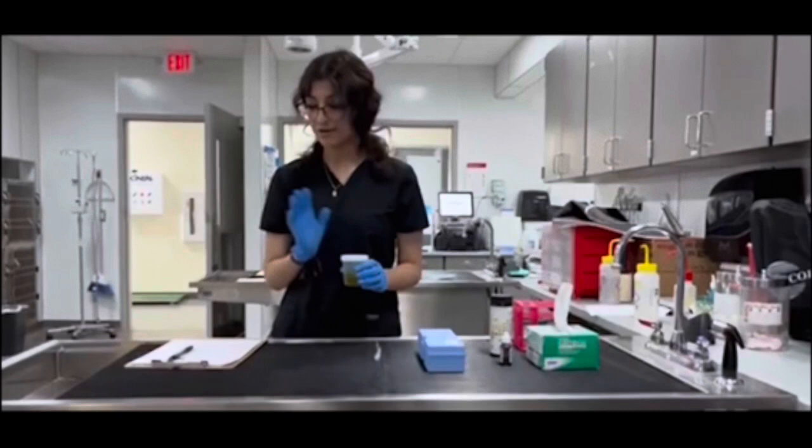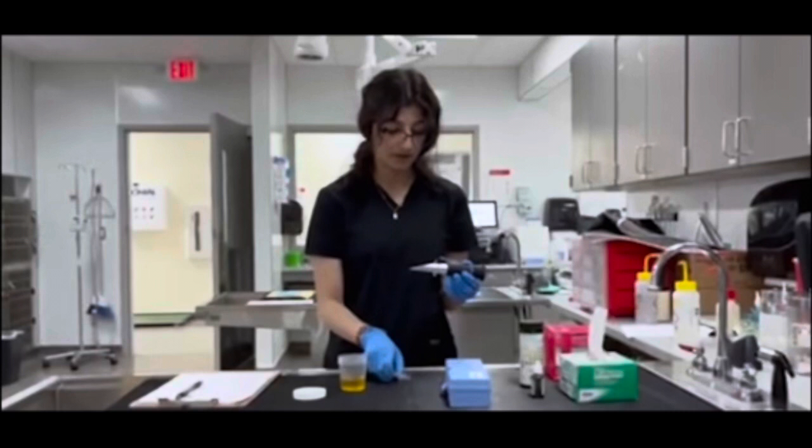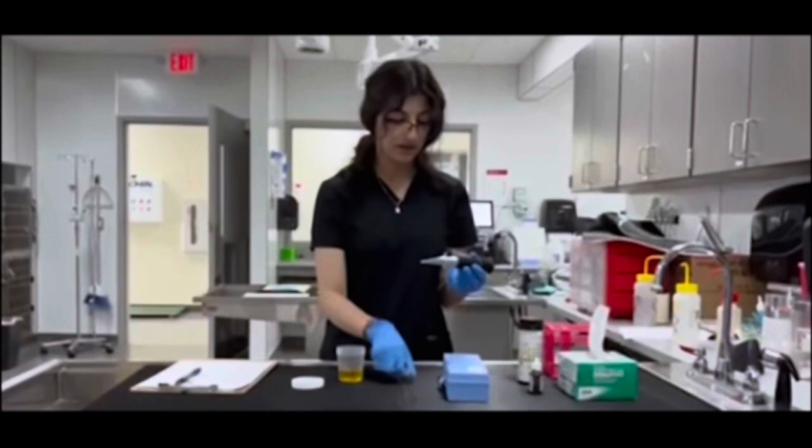Now onto the specific gravity — you just want to take a drop of urine and place it onto your refractometer. Then you want to look into the light and get your specific gravity. For mine, I got a specific gravity of 1.02, and you want to record all that information onto your urinalysis record sheet.